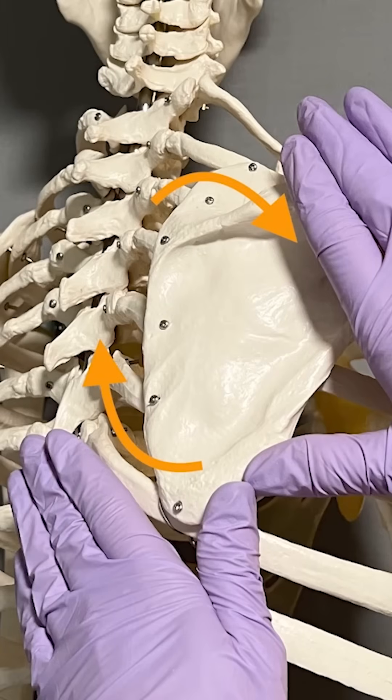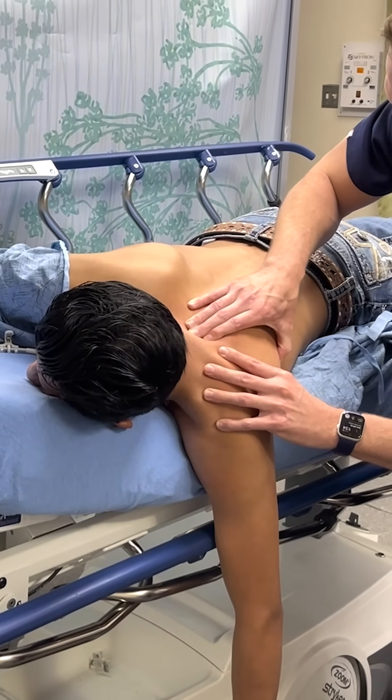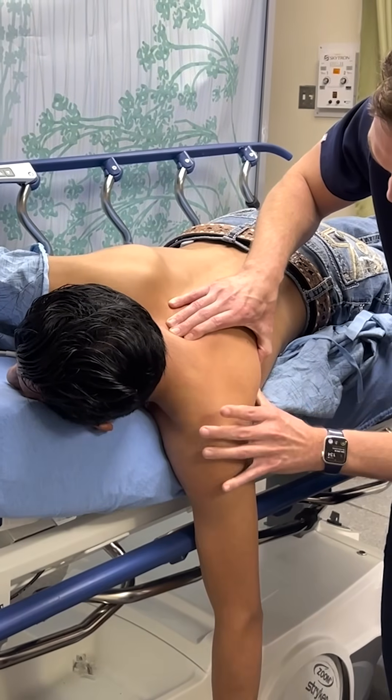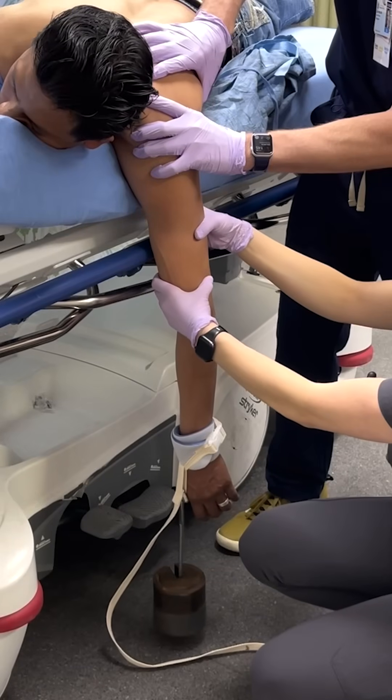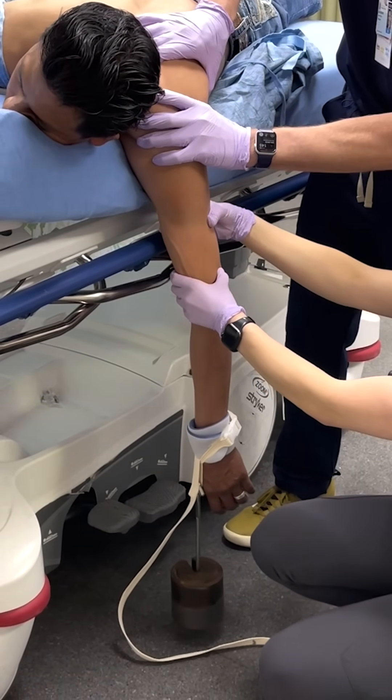Apply scapular manipulation by palpating the inferior tip of the scapula and gently rotate it medially toward the spine. This alone may relocate the shoulder, or you may have to hold it in this position. If reduction is not yet achieved, add external rotation of the arm, which in this case successfully relocated the shoulder.